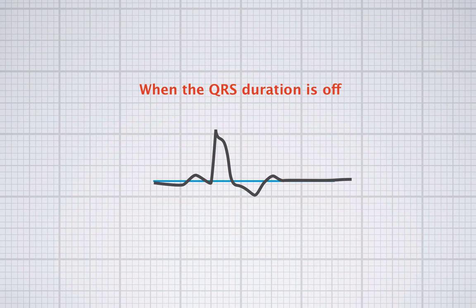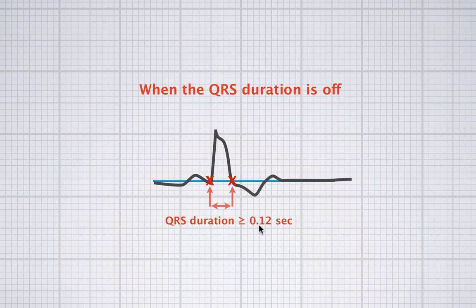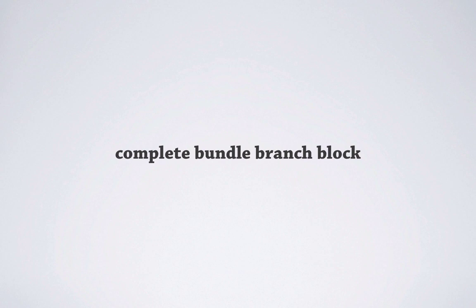Now let's look at another example — you can already see that something must be wrong here. The QRS starts here and ends here, and the duration is over 0.12 seconds. Counting it out: three and a half millimeters times 0.04 gives 0.14 seconds, which is longer than 0.12 seconds. So what we have here is a complete bundle branch block. The depolarization travels from the AV node to the ventricles through the bundle branches — there's a right bundle branch and a left bundle branch. When one of these branches is blocked, depolarization of the ventricle takes longer than normal, which is why the QRS complex is broadened.